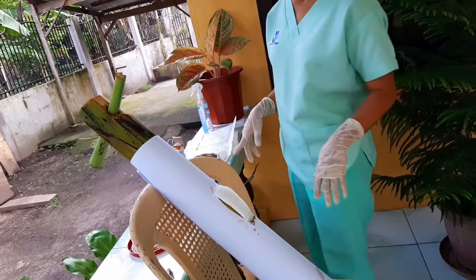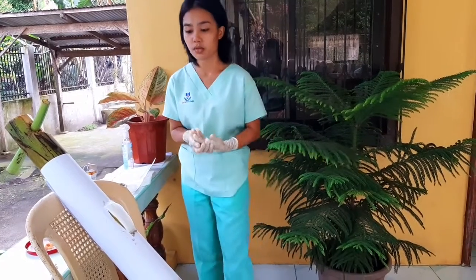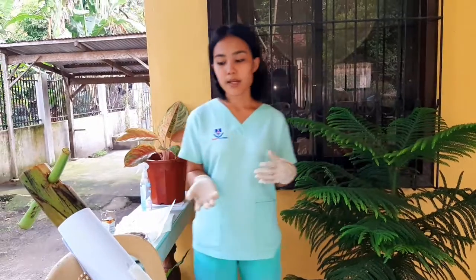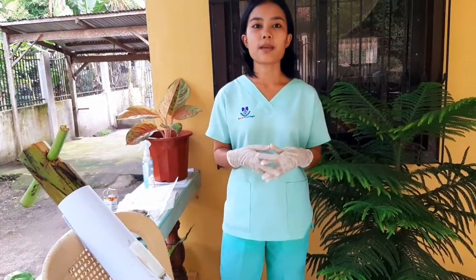I already cut a plaster so that it will be easy to paste the gauze on the patient's wound, because I'm using sterile gloves and I'm not allowed to touch anything non-sterile. Then apply the second layer of the gauze, and we can apply a thicker woven pad if ordered.